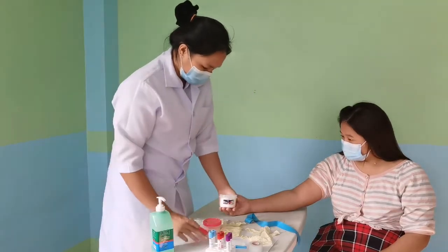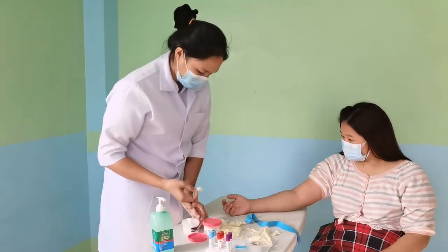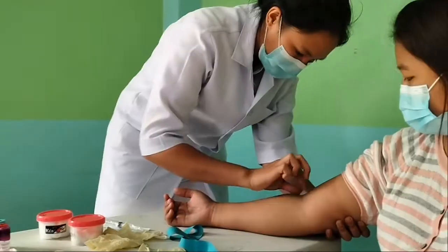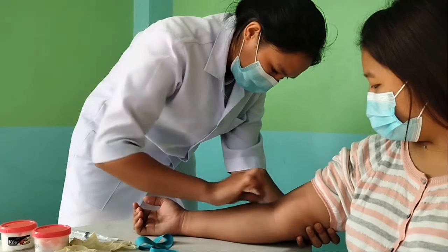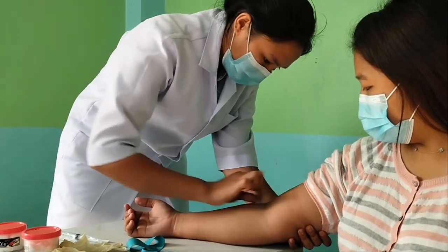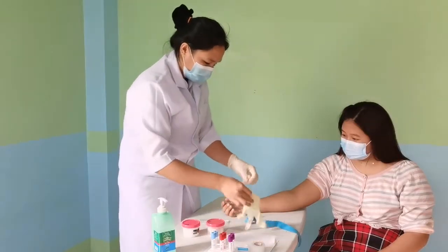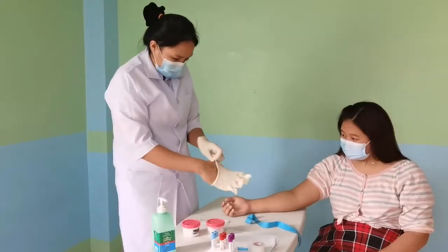Using an alcohol gauze pad or cotton balls with 70% isopropyl alcohol, clean the venipuncture site. While waiting for the alcohol to dry, put on your gloves.